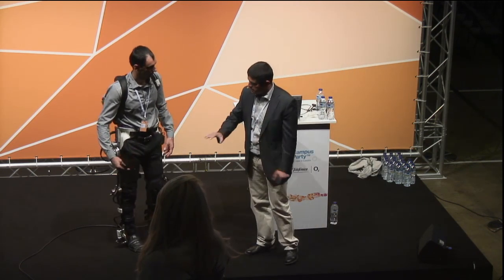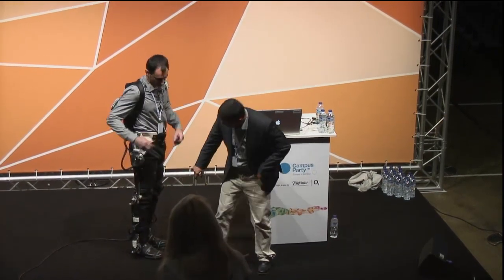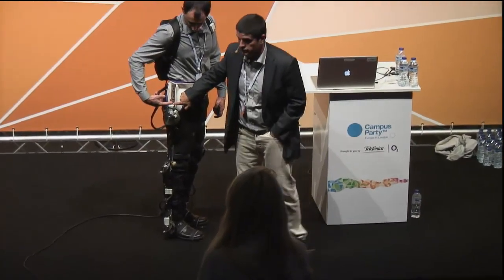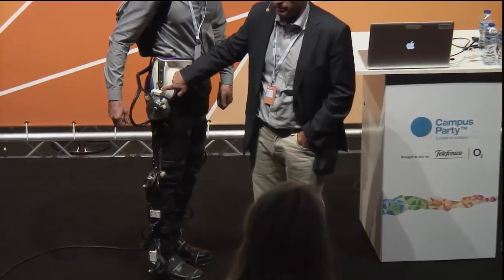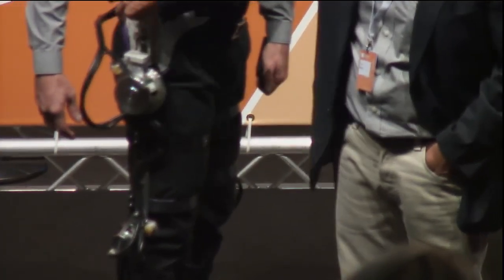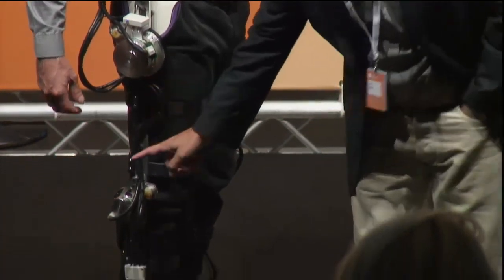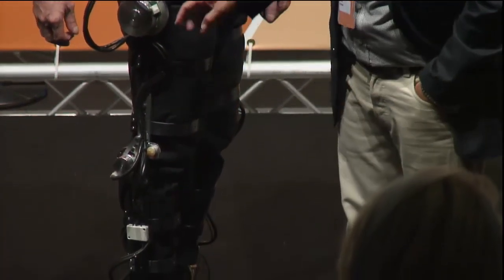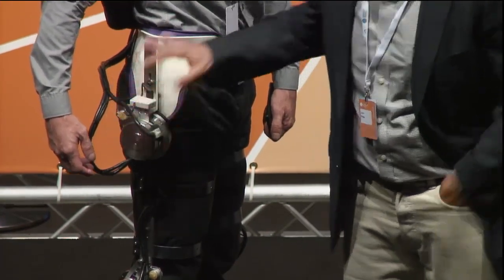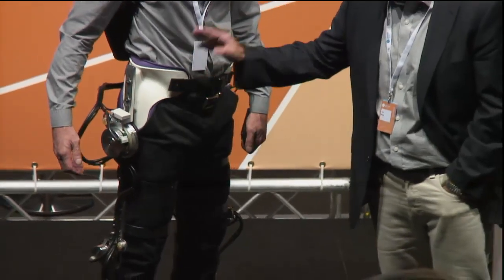So there are two different types of sensors. There are some sensors that are integrated in the structure. You see this black part here. This is the force sensor. This is measuring the force of interaction between this part of the exoskeleton and MAGDO's hip. We have the same for the different joints. And then we have position sensors and velocity sensors. These are on board, integrated in the structure.